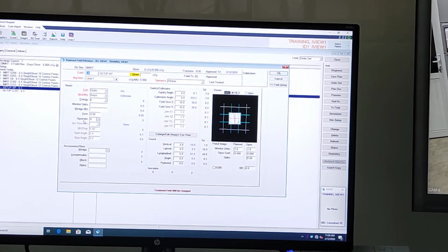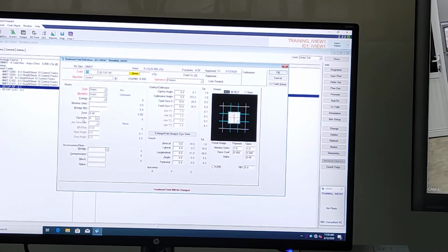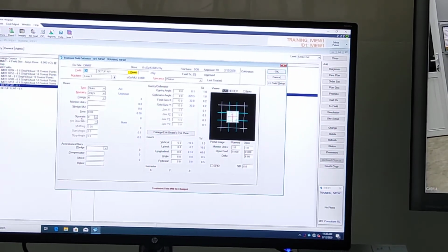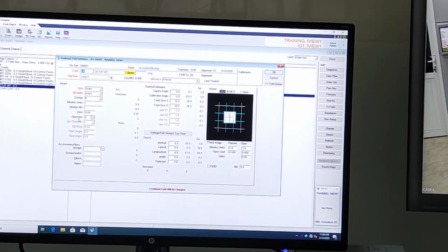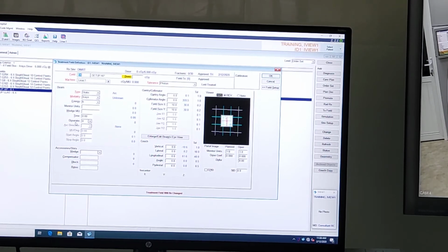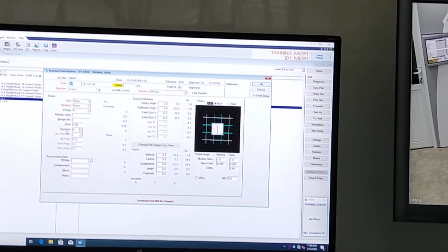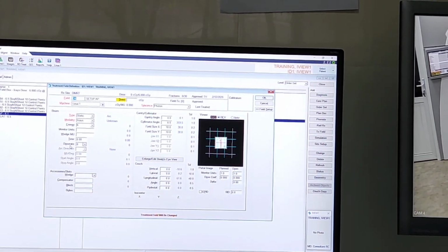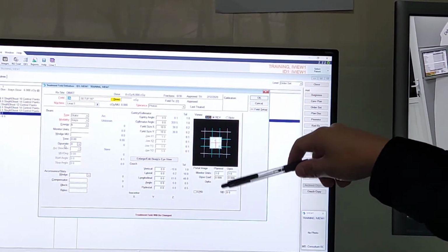For example, if I have isocenter at the head, so if I put large delta, I will accidentally expose the eye of the patient to radiation beam. And the lens has very low tolerance dose, so you already add dose to the lens. We want to avoid that, so for head, be careful, use small delta.